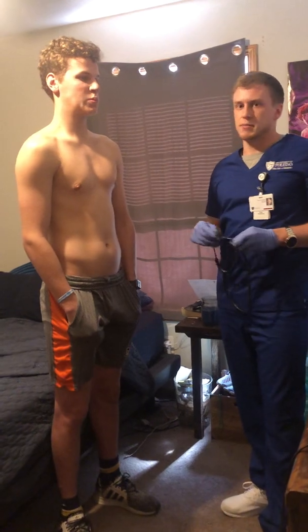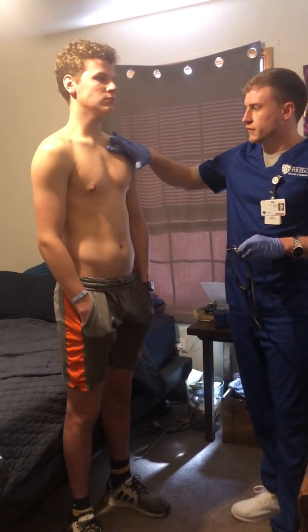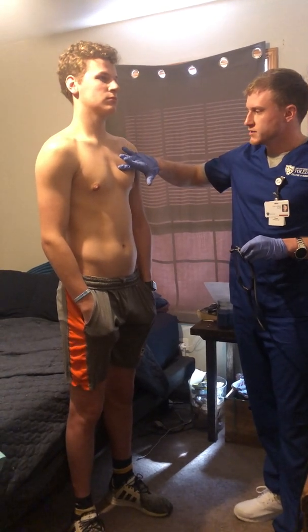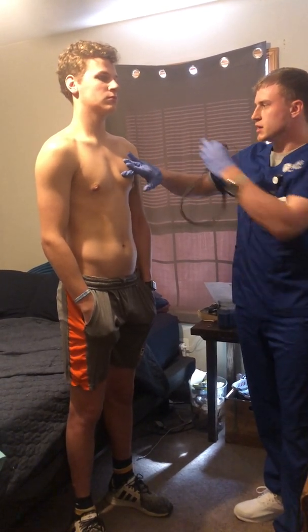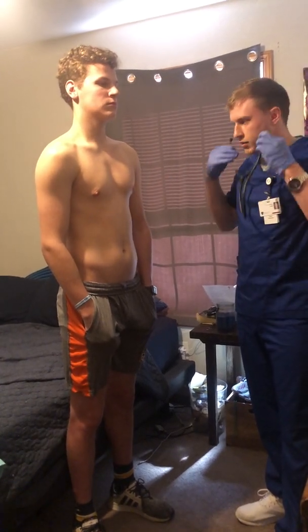The final heart sound that we're going to listen for is the mitral heart sound, which is located at the apex of the heart, which is on the left side once again, and we're going to go down to the fifth intercostal space, and we're going mid-clavicular line, so a little bit out, and it's usually in line with around the nipple line.